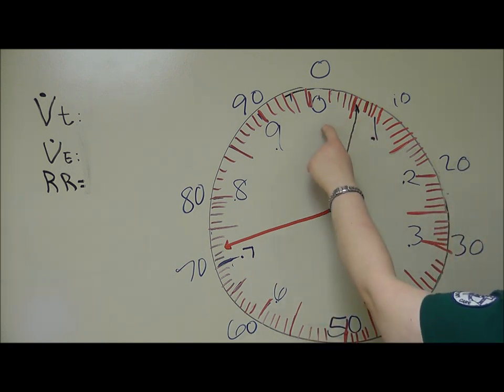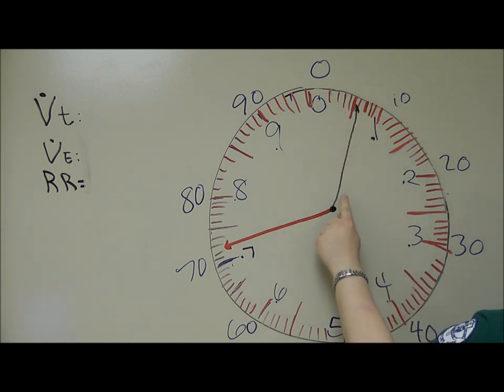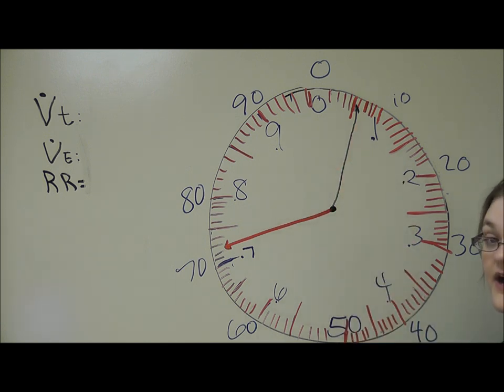So reading mine, we've got 1, 2, 3, 4, 5, 6. This hand has landed right between the 5 and 6 liters. Just like a regular clock, we're going to round the big hand back to the 5. So we're looking at 5 liters.